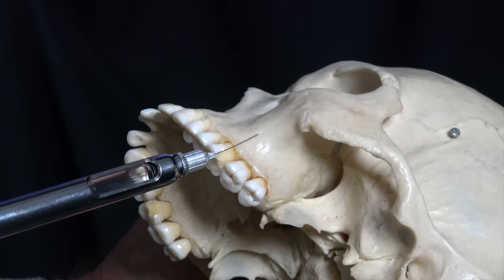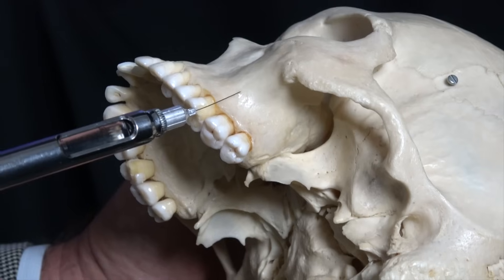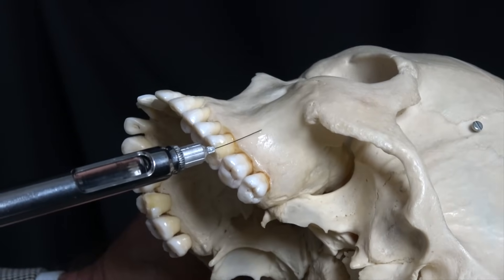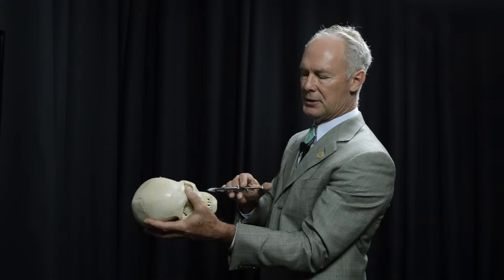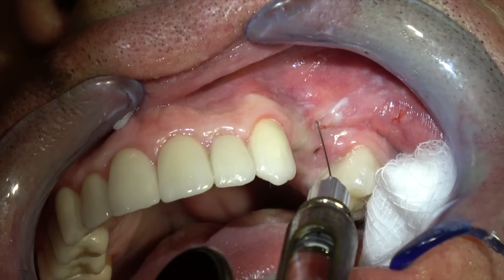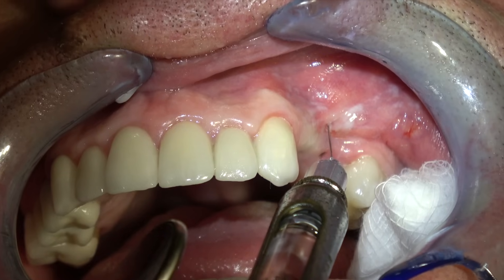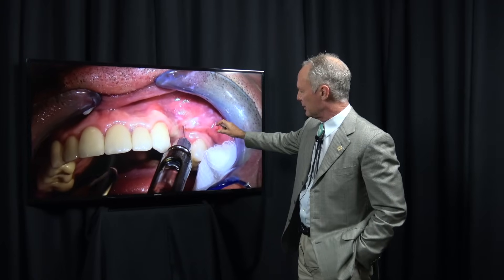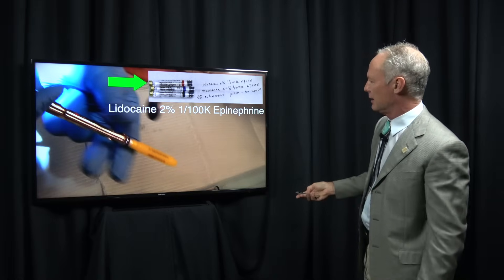Then come back and do the same thing here — barely go under the tissue, tap the end of the syringe to express just a little bit of the Citanest. The patient won't even feel it. Then go a little bit further, same thing, but always inject on the facial into the unattached non-keratinized tissue. Just slowly advance — barely under the tissue, tap, go a little further, tap — so the Citanest plain, which is pH neutral, is going to anesthetize the tissue.